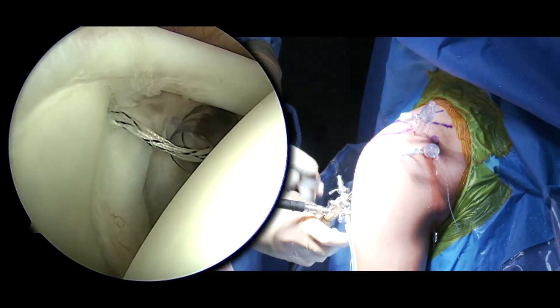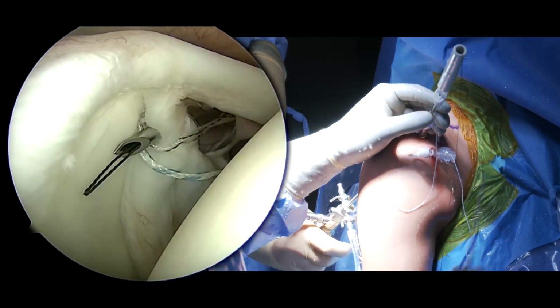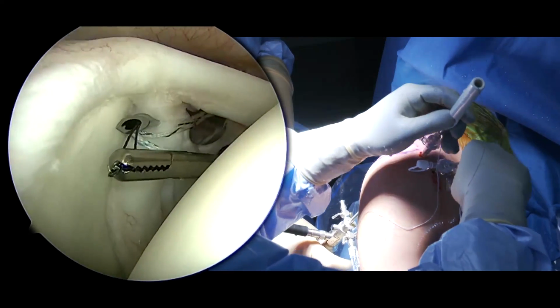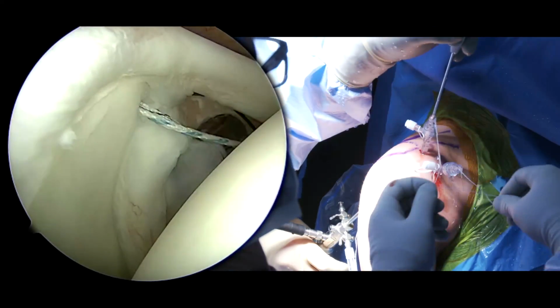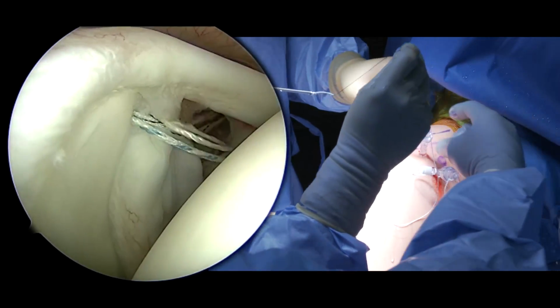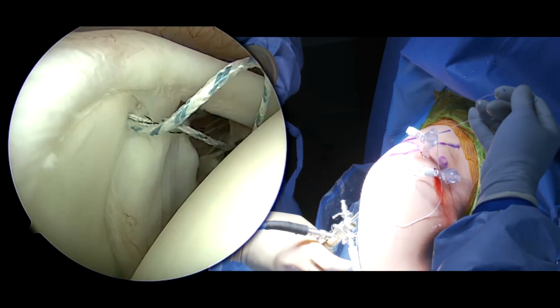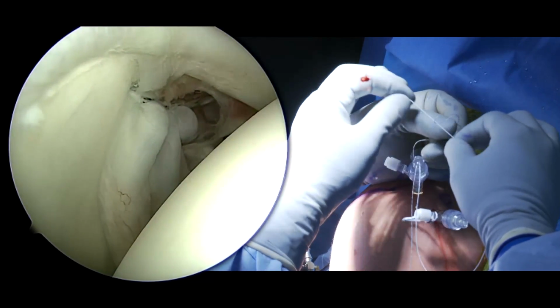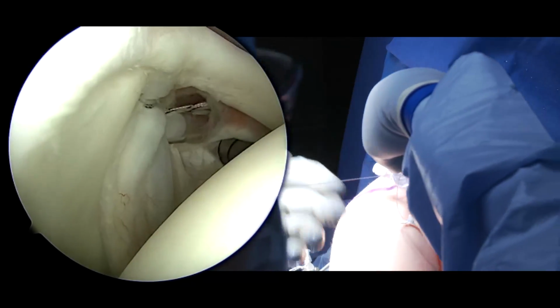A straight Crescent arthroscopic suture shuttling device is then passed through the mid-glenoid portal and around the superior labrum. Of note, great care is taken to not include additional capsular tissue when shuttling the suture around the labrum. The working suture of the anchor is then shuttled through the mid-glenoid portal and then passed back through the high anterior lateral portal. The working blue suture, as seen here, is then passed through the knotless shuttling anchor and tensioned appropriately to fixate the superior labrum.